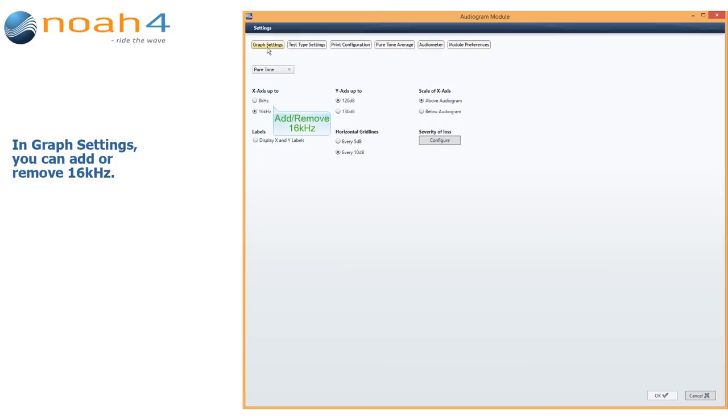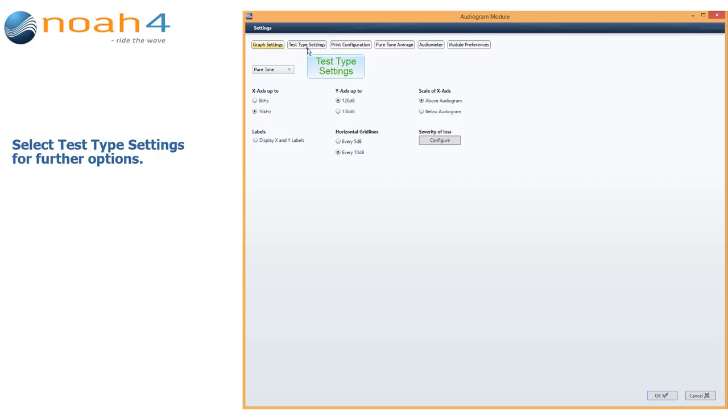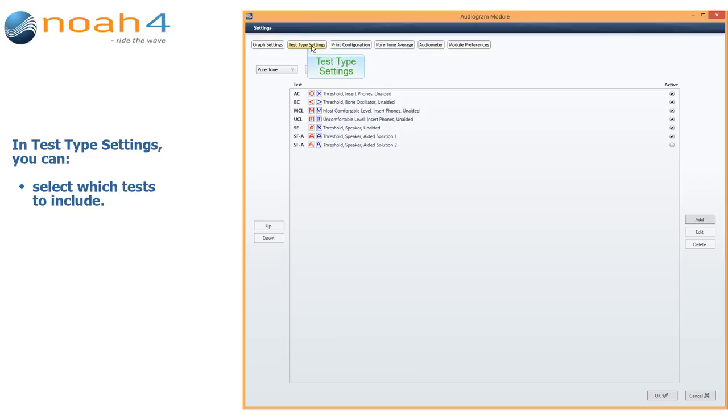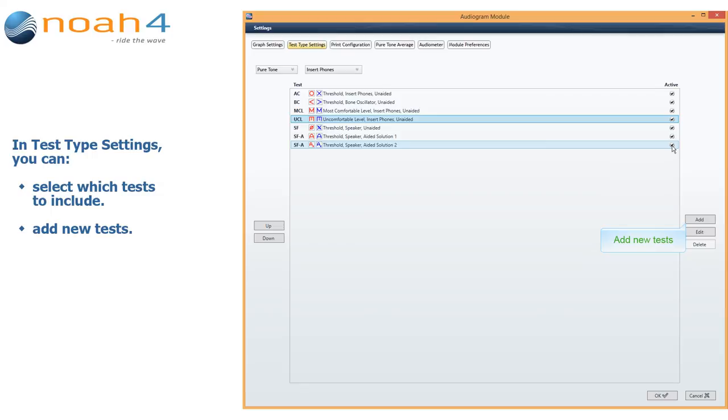In graph settings, you can add or remove 16 kHz. Select Test type settings for further options. In Test type settings, you can select which tests to include, and you can add new tests.